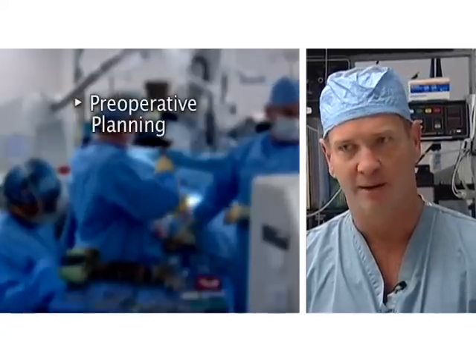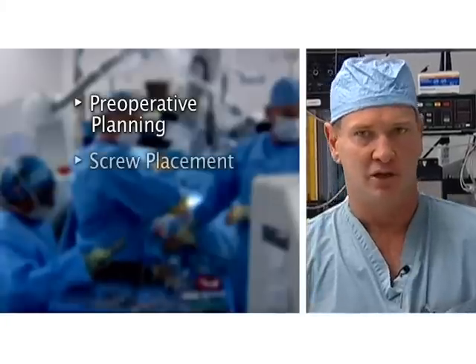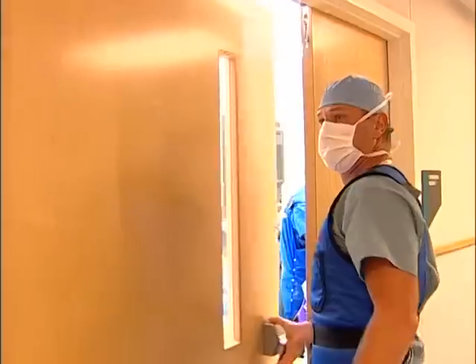There are three major phases of these procedures. One, the preoperative planning, which includes all the way up to the marking of the skin done fluoroscopically on the operating room table. Two is placement of the screws and the decompression. Three is a stabilization reconstruction phase.